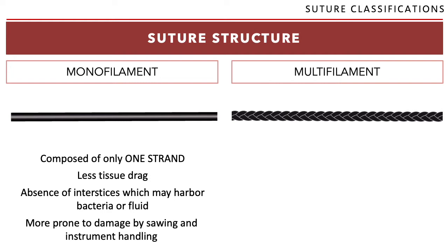Sawing is when your suture encounters another suture, another layer of the suture. Pag nagtatali ka na, that is when your suture material undergoes sawing, because they're in contact with each other, and that could actually damage it if you saw too much. But usually it's not a problem.